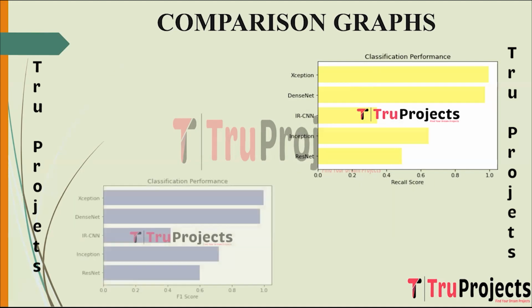false negatives. This is the F1 comparison graph. On the x-axis, we have F1 score, and on the y-axis, we have algorithm name. F1 score is the harmonic mean of precision and recall. It is a balanced measure that considers both false positives and false negatives.